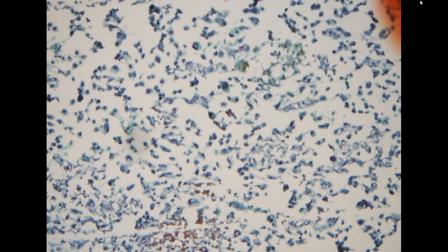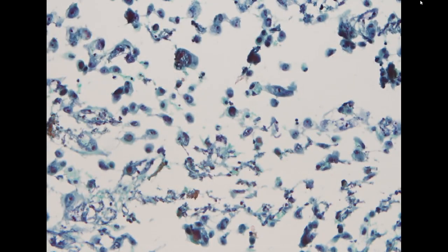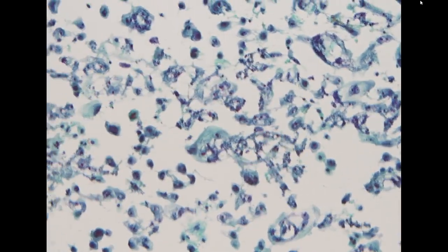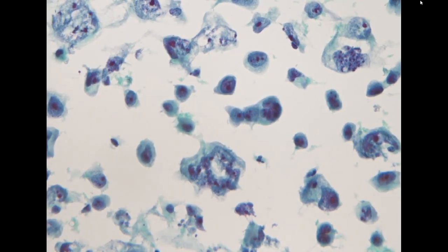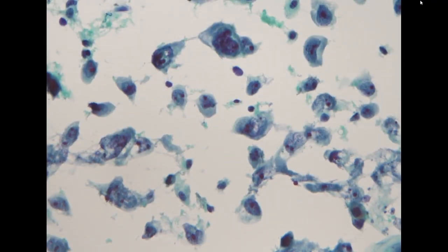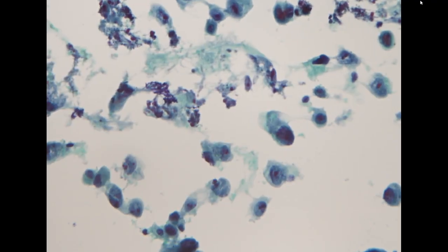The next specimen, also a pleural effusion, is from a patient who does have a lung cancer history. He had a history of lung adenocarcinoma. The specimen is not very well preserved, as you can tell. From the smearing, the cells are distorted, but you can still appreciate that these cells are really ugly, with a really irregular chromatin pattern, pleomorphism, and gigantic nucleoli. So these are positive for adenocarcinoma and compatible with recurrence of the lung cancer.